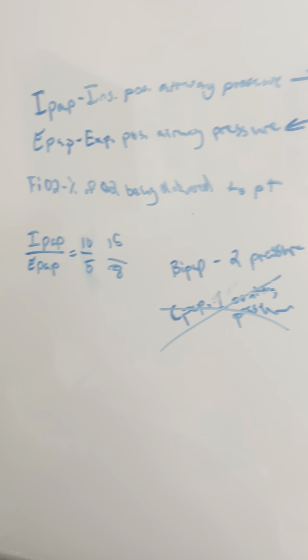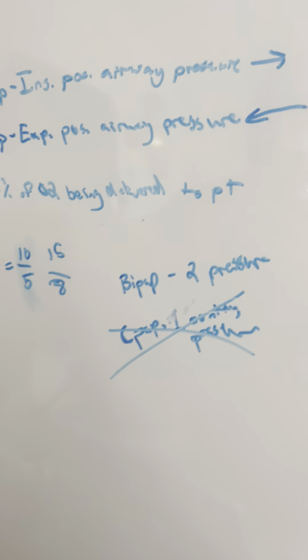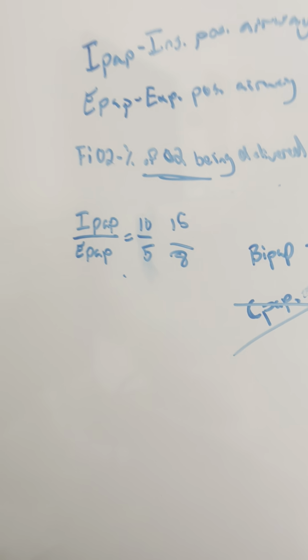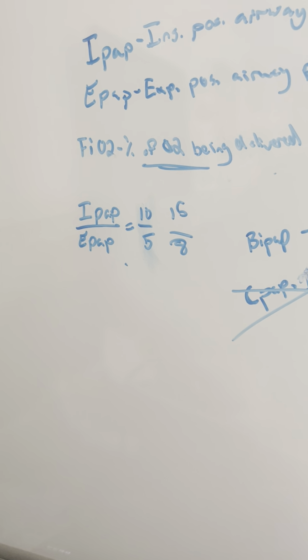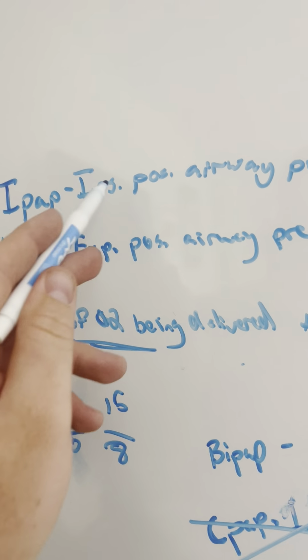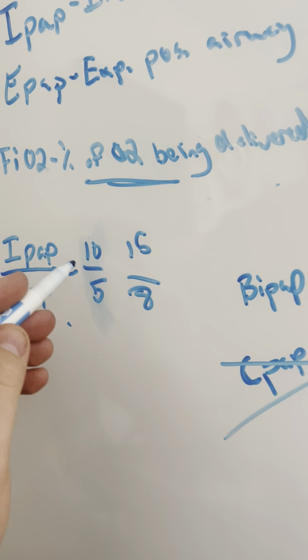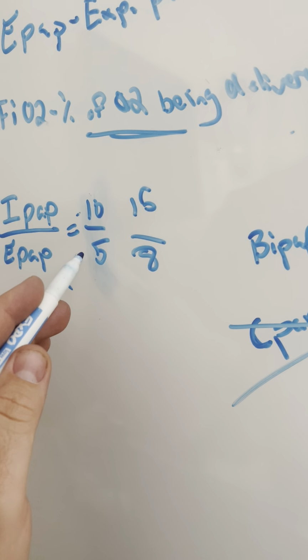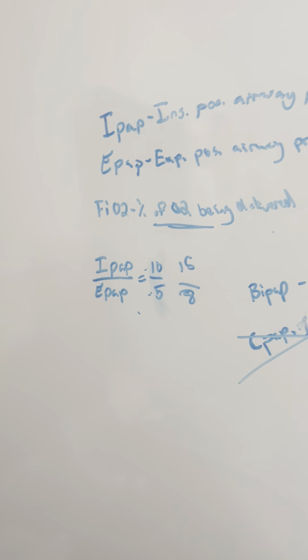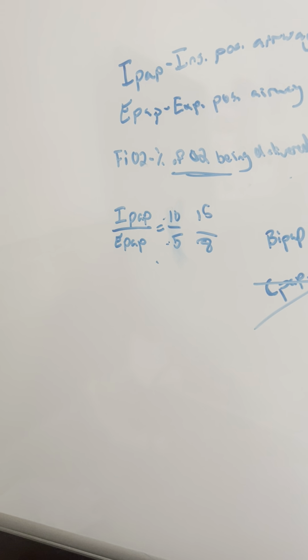There's another benefit. As we know, most of these patients live in a hypercapnic state. We don't have to use nearly as much O2 with this. And the reason for that is because, once again, the two different pressures. You're giving them a higher pressure gradient here and a lower one here. So this is allowing them to fully relax when they take that exhale.